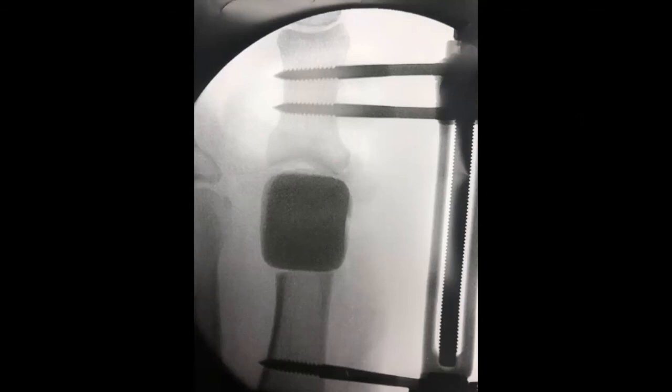Where can we harvest that bone graft from? This is a different patient, but you can see where the bone graft was harvested — there's a cutout visible in the calcaneus. You can pack it with cancellous chips. Sometimes if you take a huge graft, you may put a screw across it just to help prevent a fracture.